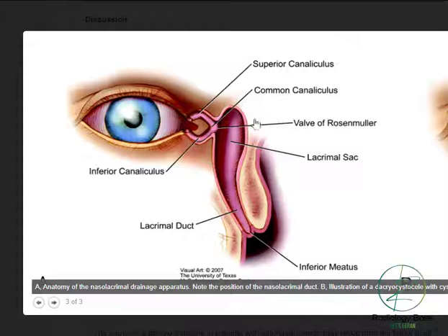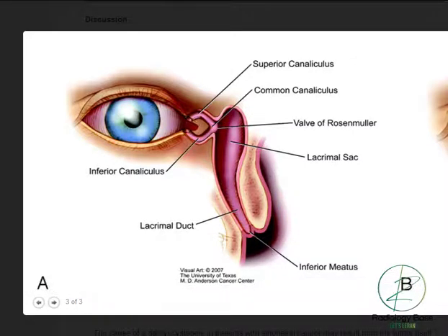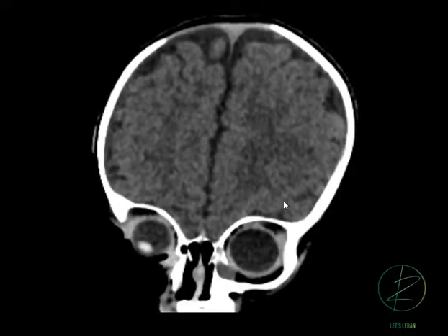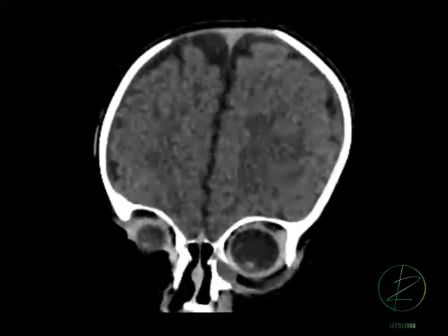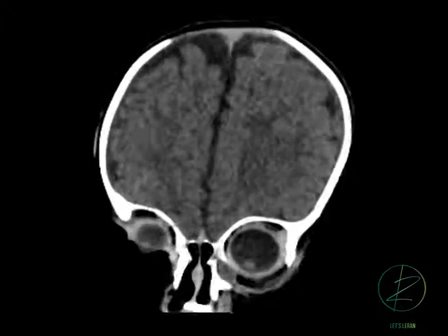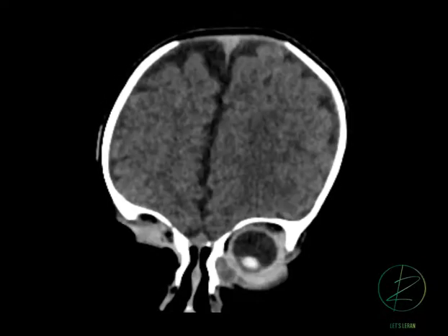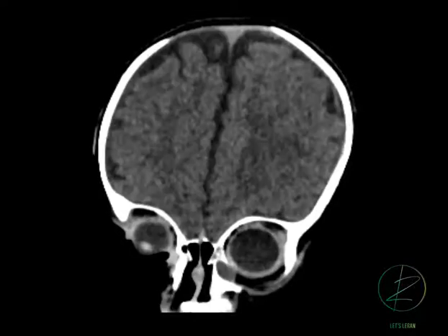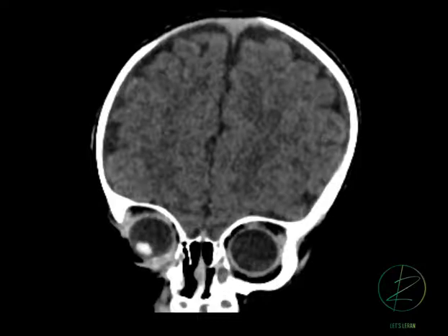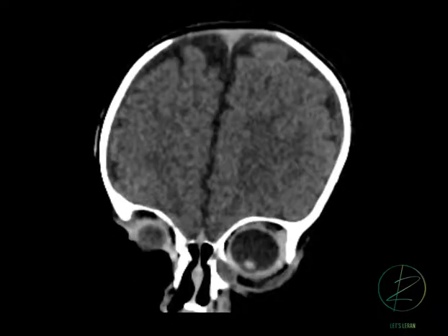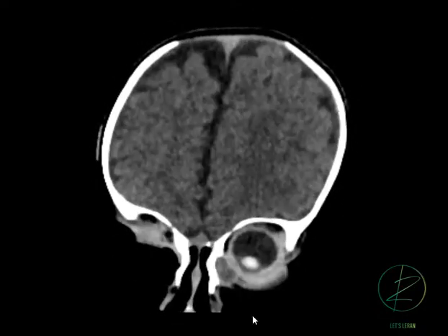The lacrimal duct goes inferiorly and opens in the inferior meatus. If this region blocks, it will cause a swelling of the lacrimal duct and form a cystic area — you can see in this picture a cystic area along the medial canthus extending into a lacrimal cyst. This is known as a dacryocystocele, and it extends from the medial canthus inferiorly up to the inferior meatus, which is the normal opening of the lacrimal duct.